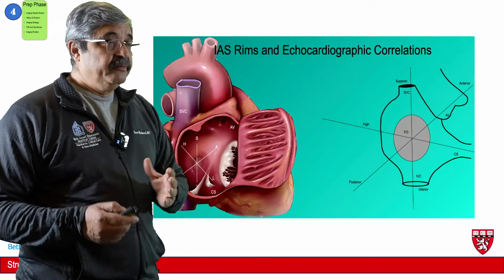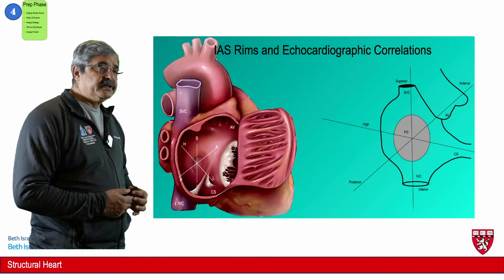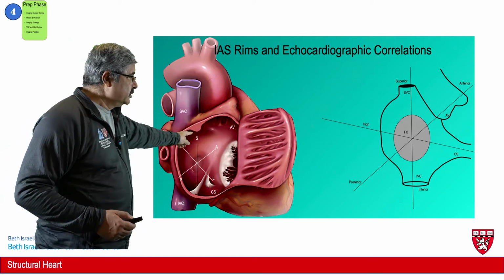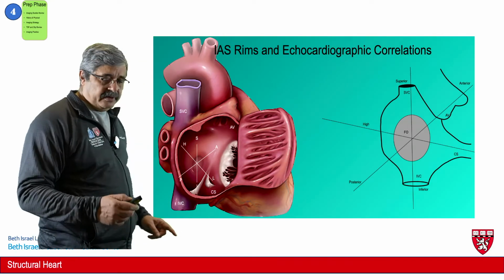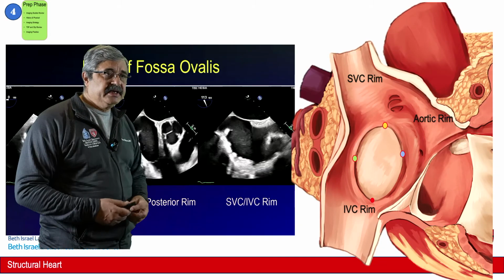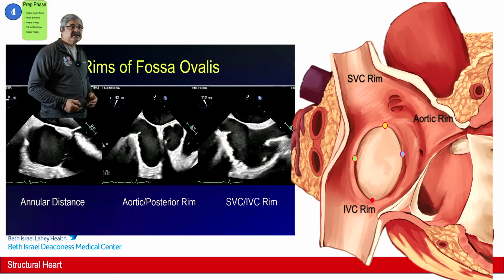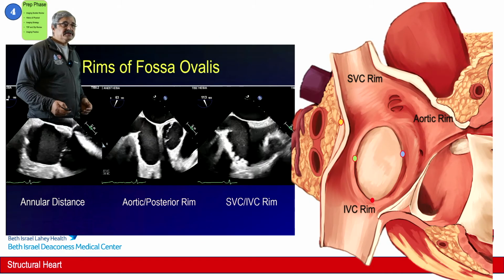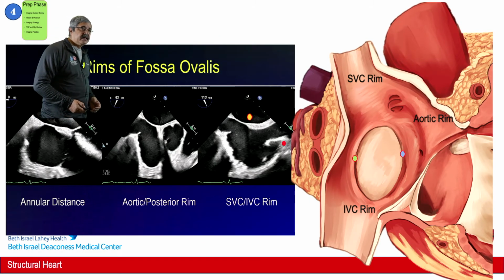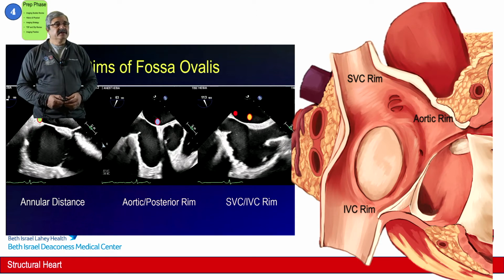Most of the time, we consider these four views of the interatrial septum, which are superior, inferior, anterior, posterior, low, and high. And we'll go over each of these images in a second. As you can see in this specific graphic, the superior image is in relation to the superior vena cava. That's the inferior margin of the fossa ovalis. That's the anterior margin related to the aortic valve. And then we have the posterior margin that we look at in the mid-esophageal four-chamber view.